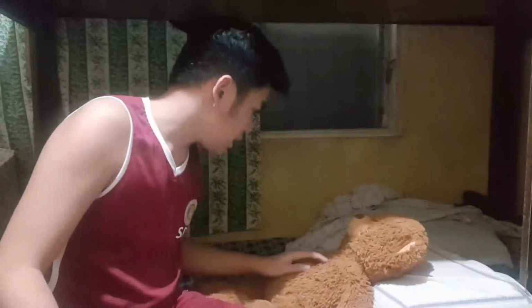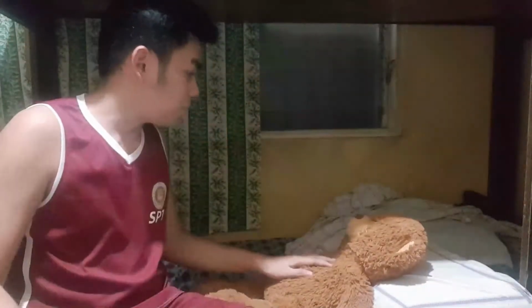So, first, just for your information, ma'am, I will be using a frequency-specific microcurrent modality. This will be used to address the pain that baby feels. Okay, baby? Kaya mo yan. Ito na, huwag tanong, baby, ha? Okay. So, I will be starting na, ma'am.